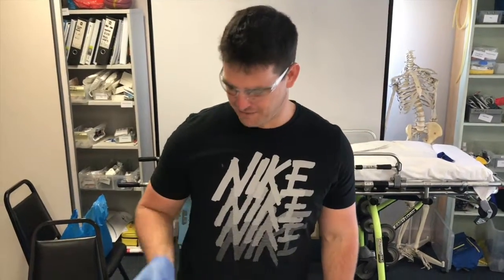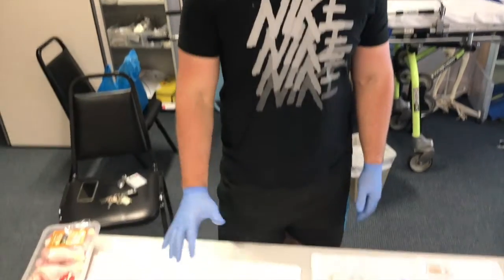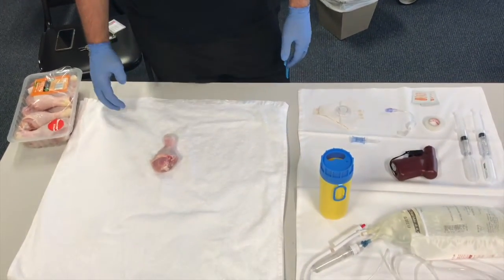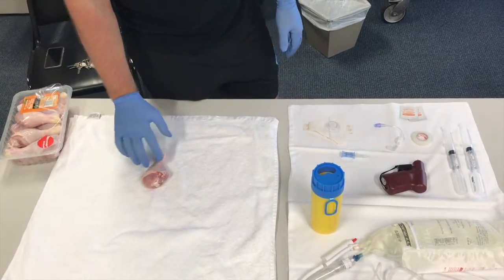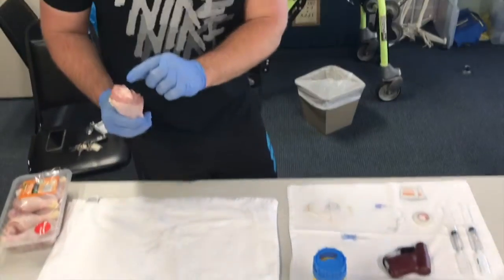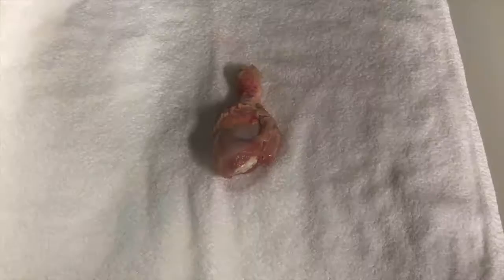So for this demonstration of inserting an intraosseous needle, I'm going to use these scrumptious chicken drumsticks that I got from Woolworths. The use of a drumstick is a good idea because it's the most realistic example of putting an intraosseous in other than a real person. They provide the muscle and the soft tissue and the fat around the bone, and you can easily identify the tibia inside the chicken drumstick and then feel for these landmarks.